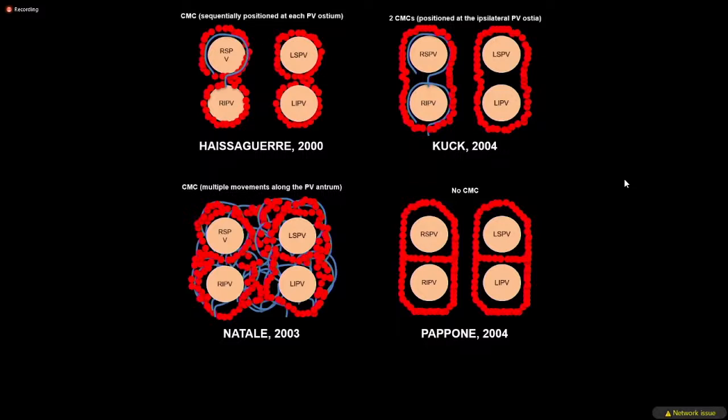Imaging: we were the first users of intracardiac echo. If you use a phased array intracardiac echo, it's very obvious that the pulmonary vein extends posteriorly into a common ostium. It's much more common than what you see on a CT or by angiography, where usually you miss this posterior extension.